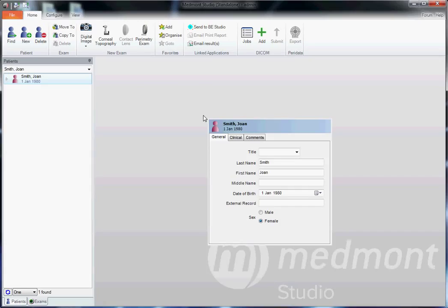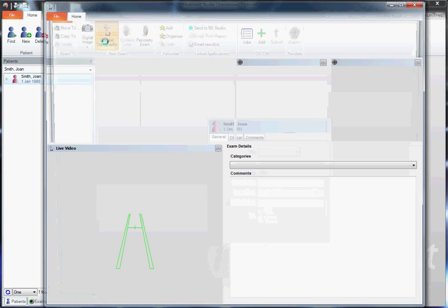This video reviews the basic functions that you might use in your Medmont E300 corneal topographer. Start by creating a patient or selecting from an existing patient, then click capture topography.